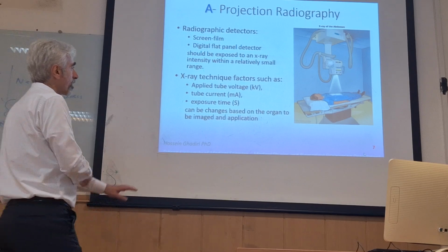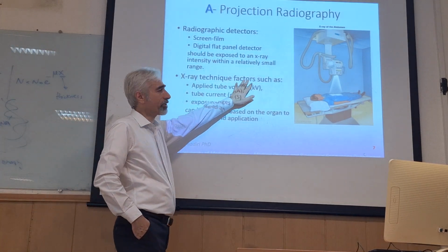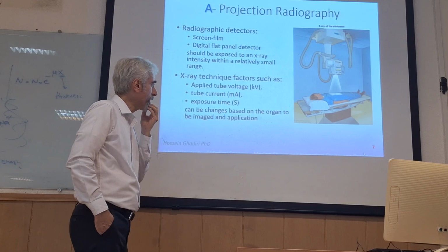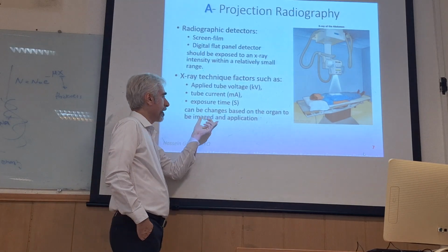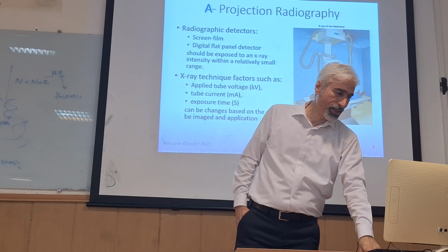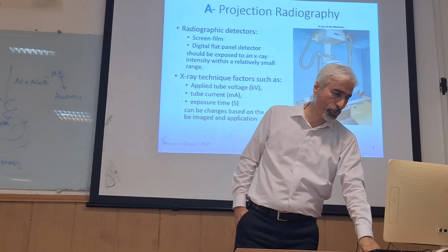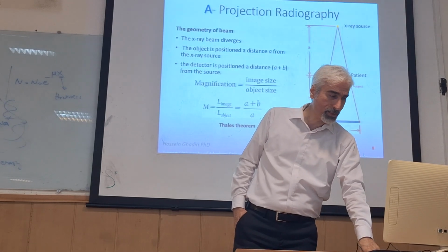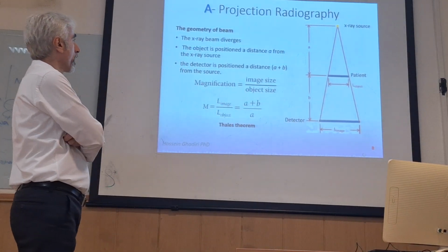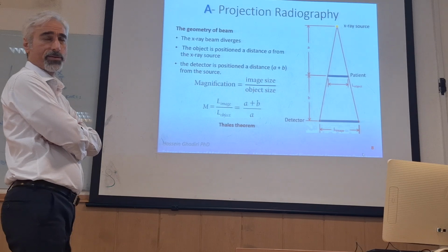As I said, X-ray techniques factors are important: applied kV, mA, and exposure time. Based on the organ, the application, and the patient size, they should be appropriately adjusted based on the patient or organ of interest.